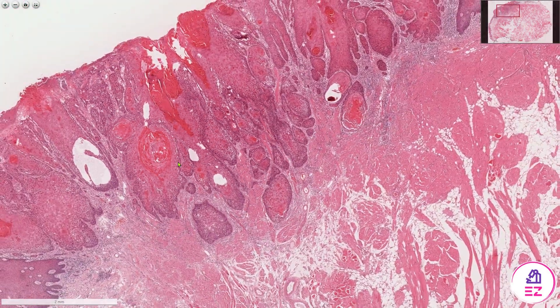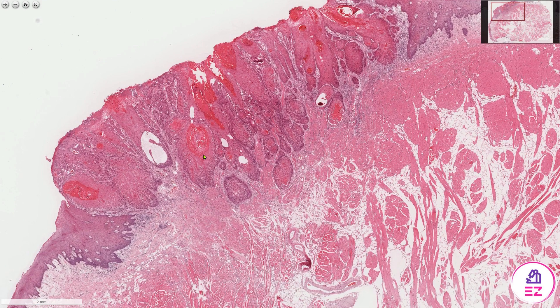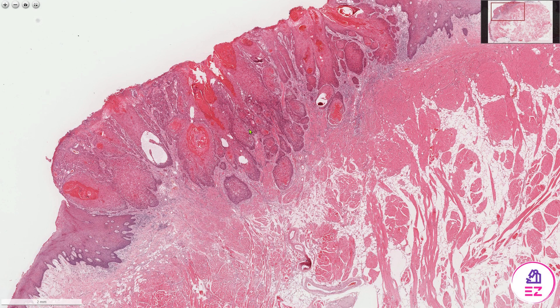One of the things we'd record with regards to this tumour is the depth of invasion. You have to take a line from the adjacent epithelium and then drop down to the lowest point of invasion. Approximately two millimetres, because this tumour does have an exophytic component which we wouldn't count.